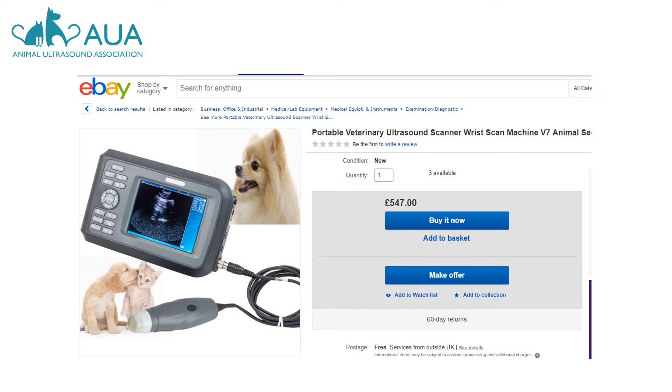On this eBay listing here, I personally can't discern anything from the scan image they're using to advertise their machine, and I am a trained sonographer.